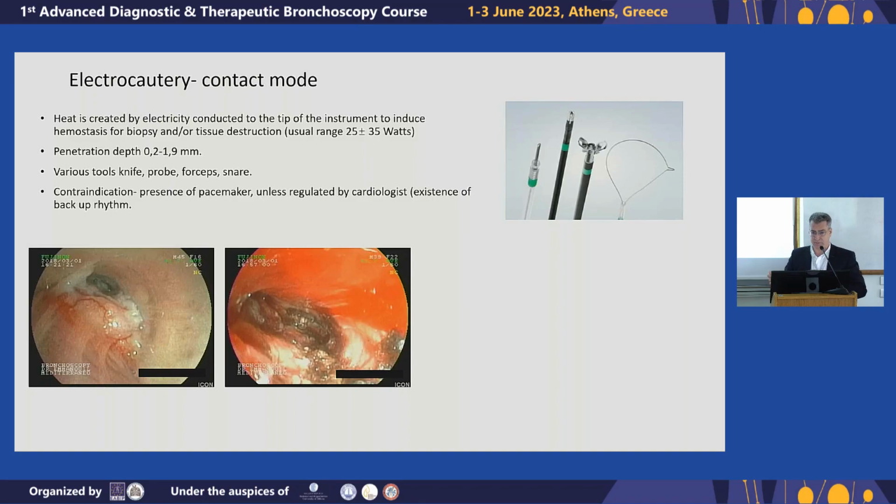because if by any way the modulated rhythm of the pacemaker is disturbed, then the basic rhythm still keeps on. Because some patients that have a pacemaker do not have a basic rhythm. If the pacemaker is disturbed, the heart stops beating. So this is very important. Usually when we have such a case, we have a specialist, a cardiologist, with his machine ready to modulate the machine. We set it on a ground level of 70 or 75, depending on the patient. And if by any way we have a disturbance, he has to be ready to put a temporary pacemaker.